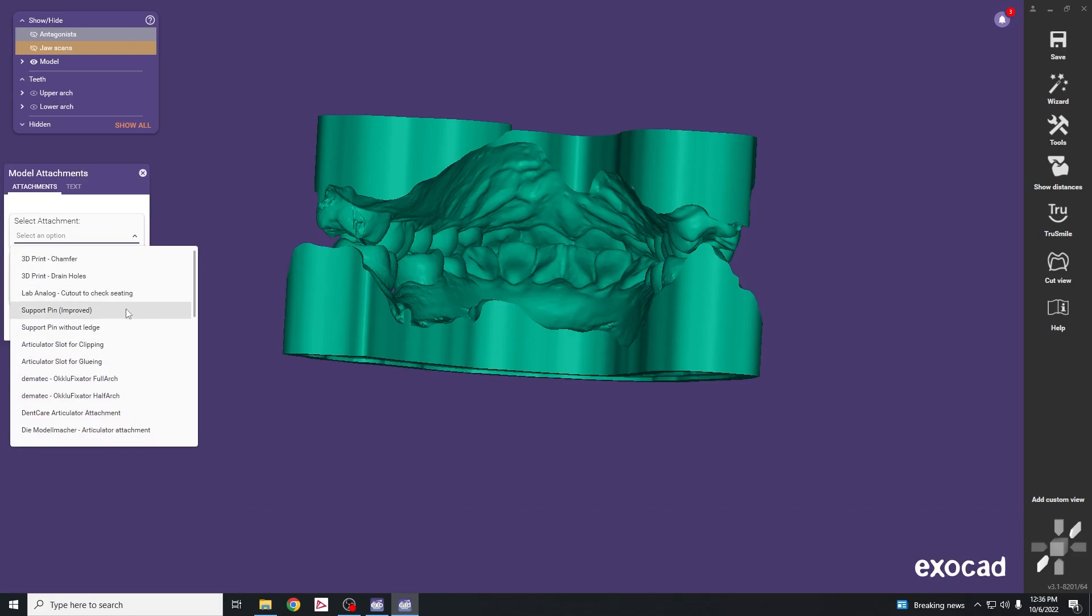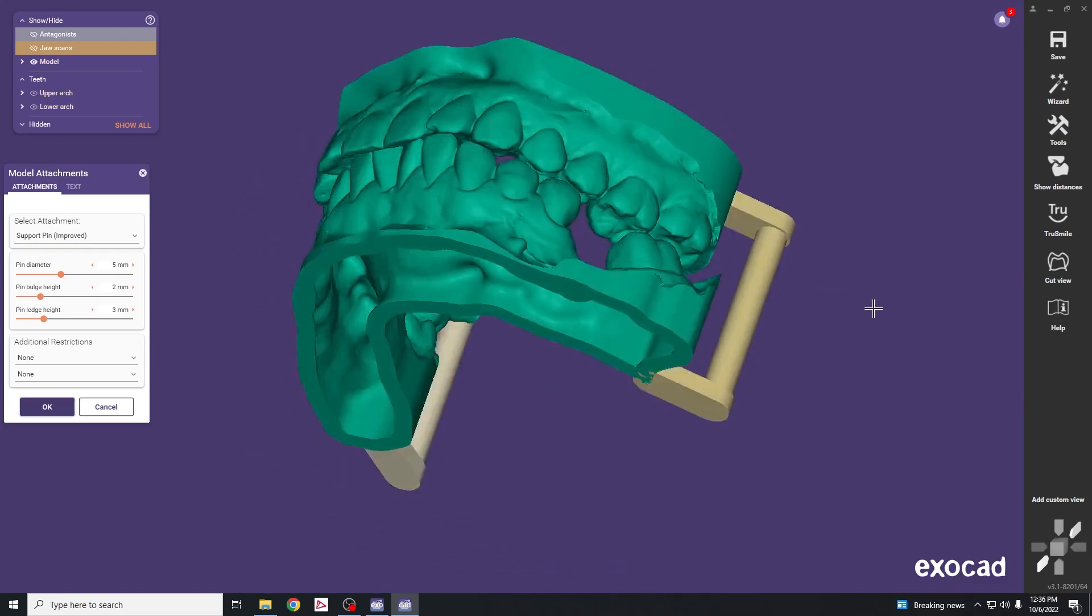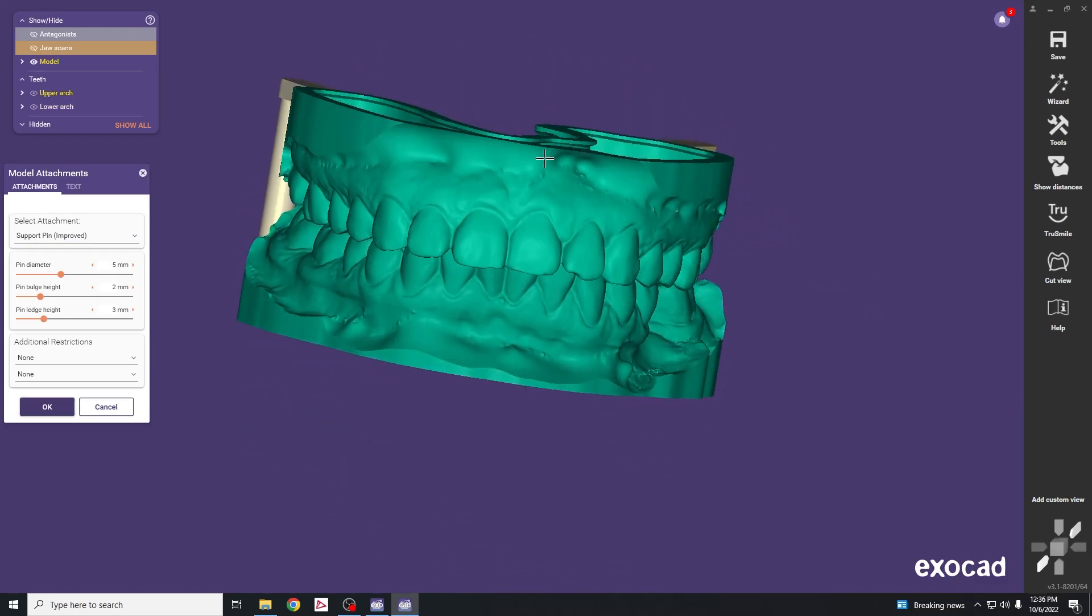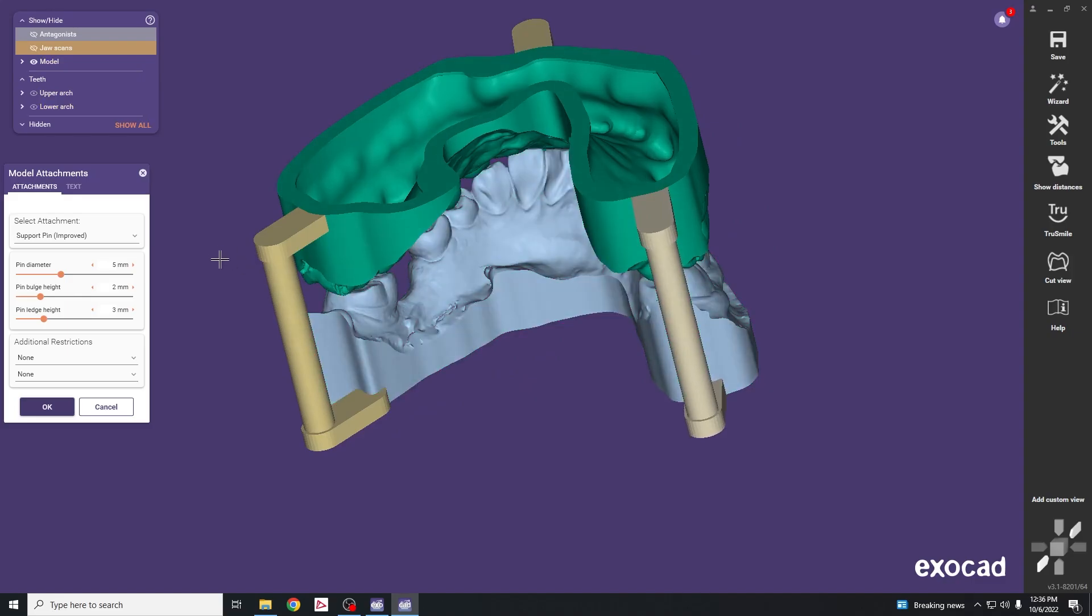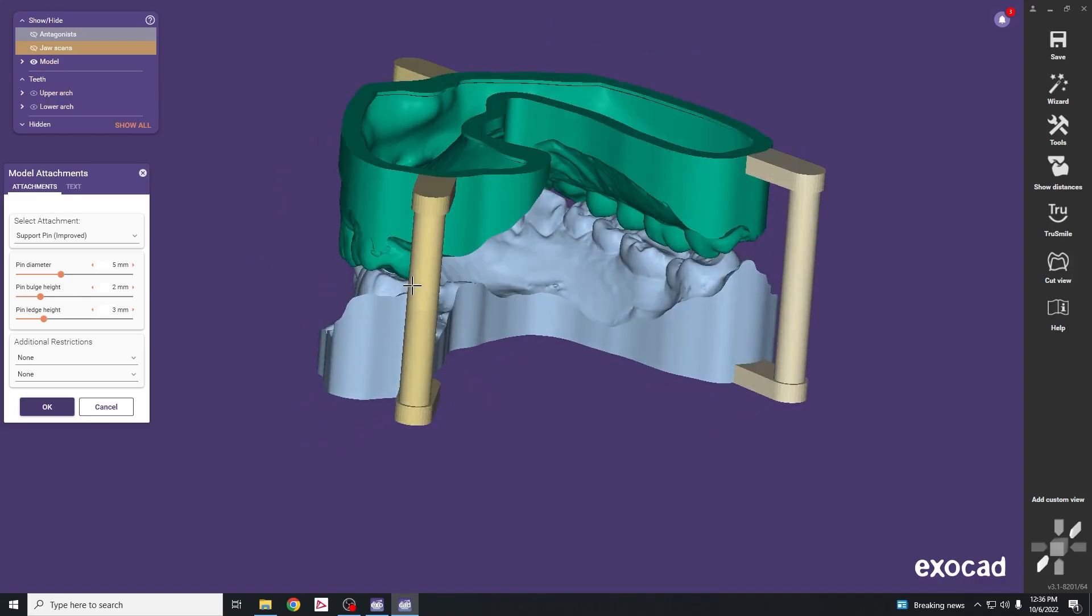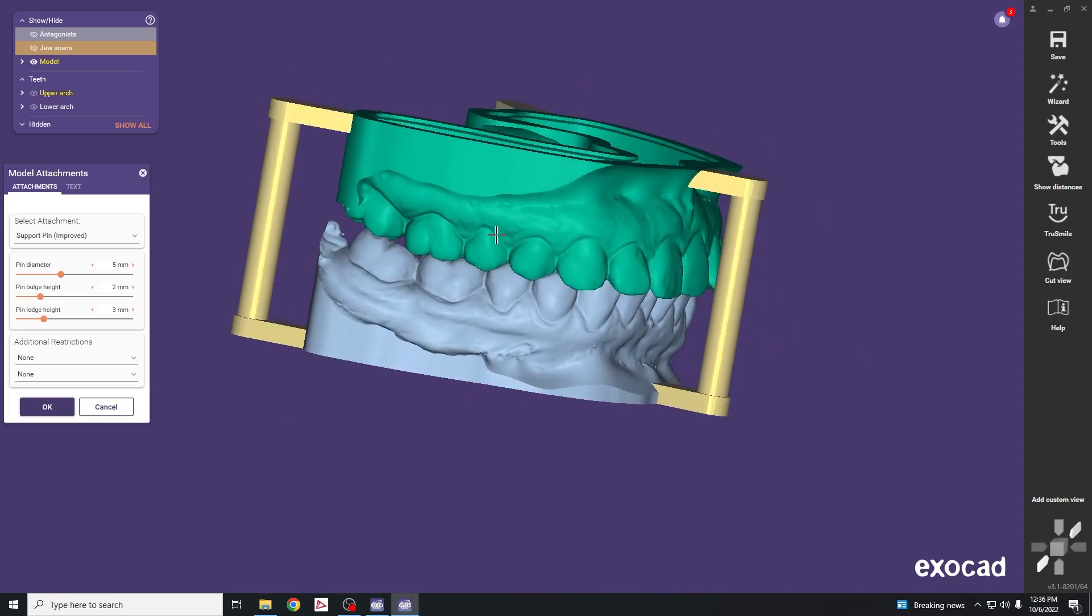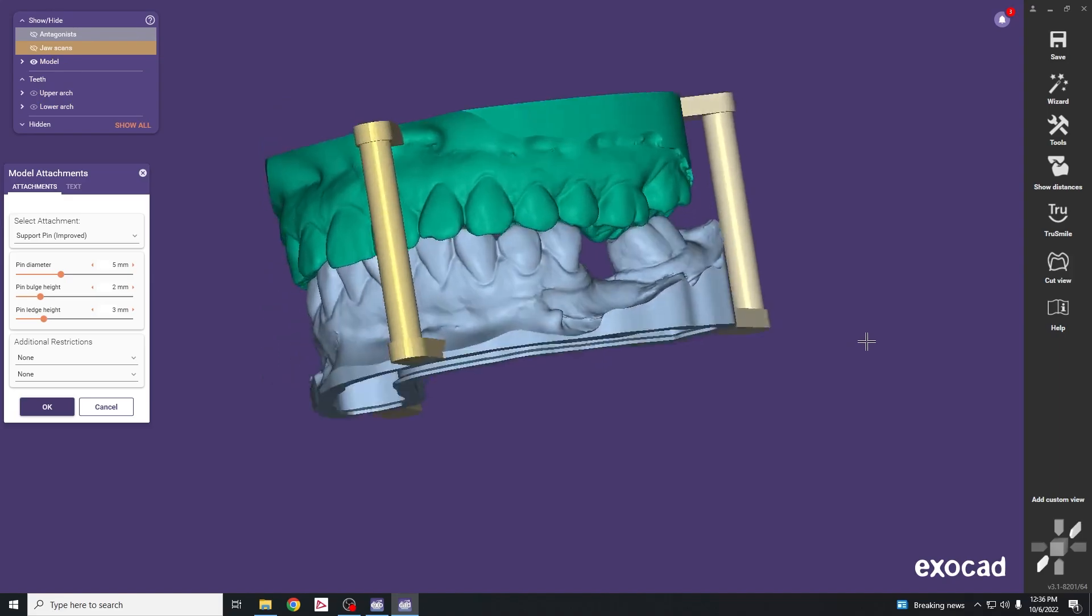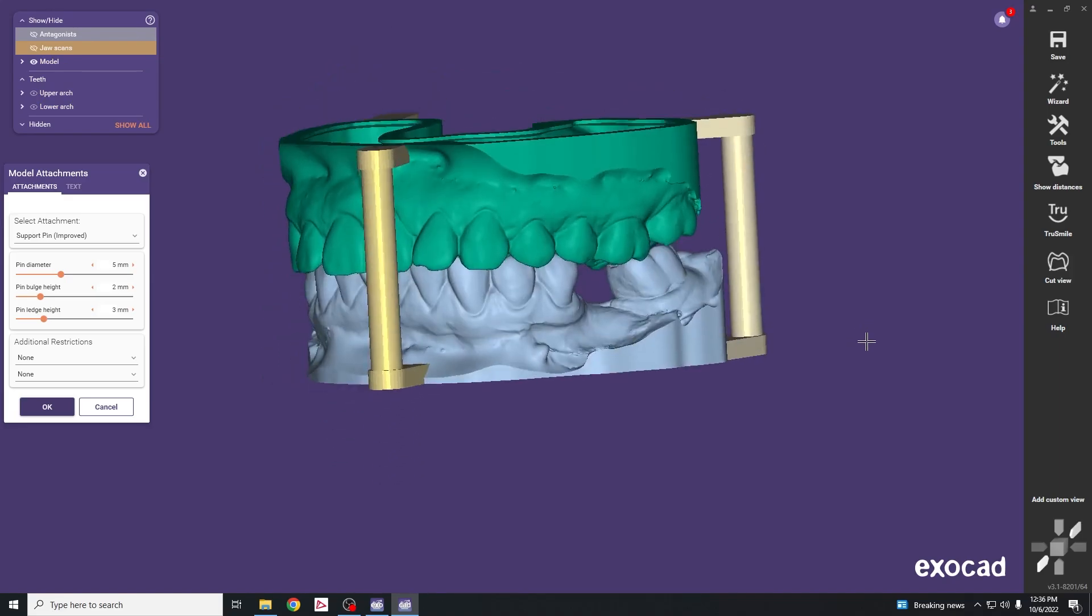One we can use is a support pin. Click on the areas where you want to add these support pins and left click and drag them into the positions you want. Generally three of these will help stabilize the cast, especially if you're missing a lot of posterior teeth and you're unable to tripodize the case in MIP.